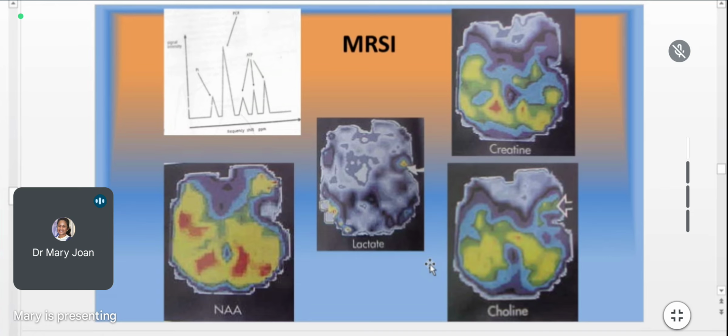So this is some of the images. The differences are picturized like this. Wherever there is a low activity, there is a high activity, there is high net magnetization, less net magnetization, all that can be seen.